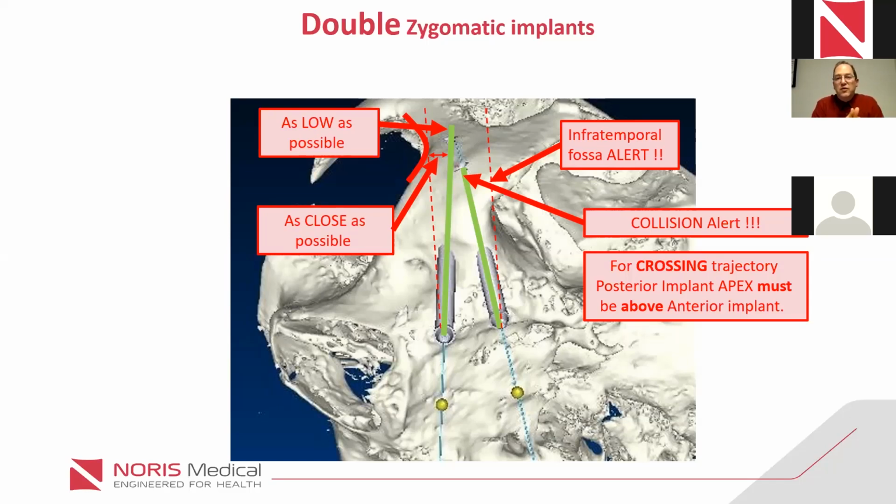It could go a little bit further out, as long as the surgeon puts the finger and the implant goes, and the surgeon doesn't feel the implant in the finger, you can go further out. Because if you do feel it in the finger, then the patient might feel it when he puts his head on a pillow. But if you don't feel it, then it's basically okay, and you have bicortical anchorage.